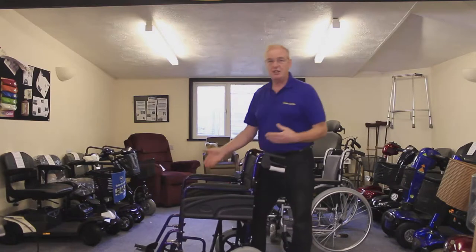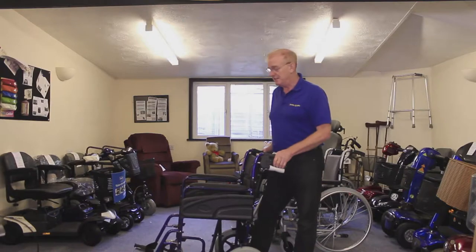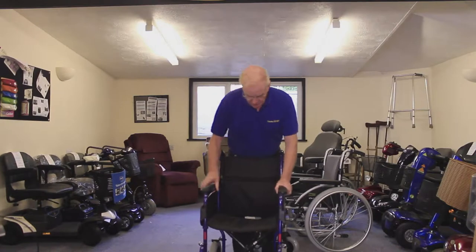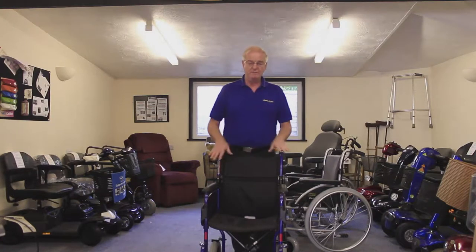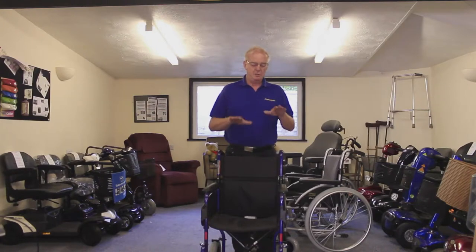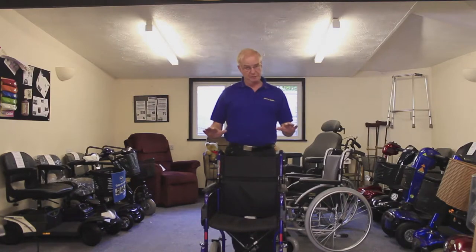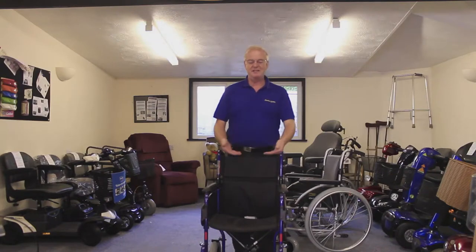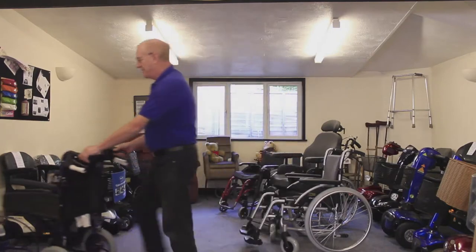The person in the chair can't take the brakes off or put them on, so it's entirely designed for the attendant. This is a basic lightweight chair. You can see there's quite a height difference between the armrest and the seat, which would probably require a cushion. The person sitting in the chair should always be in a neutral position — their arms should neither be pushed up but should be supported. So this chair would need some form of cushioning, but nothing too special as it's designed for someone to be pushed around in occasionally. That's the transit chair.